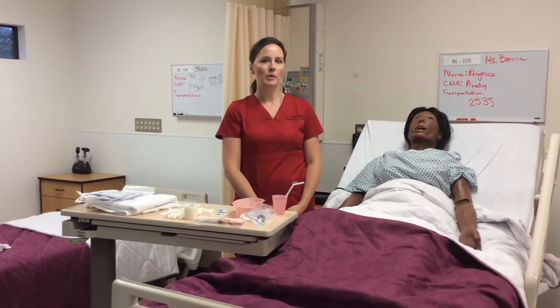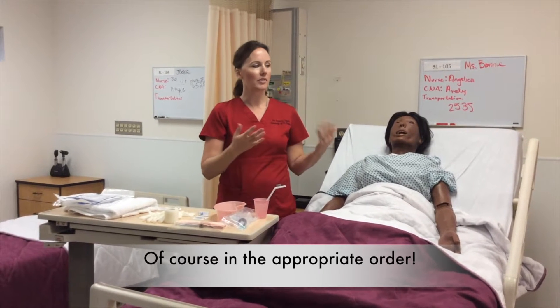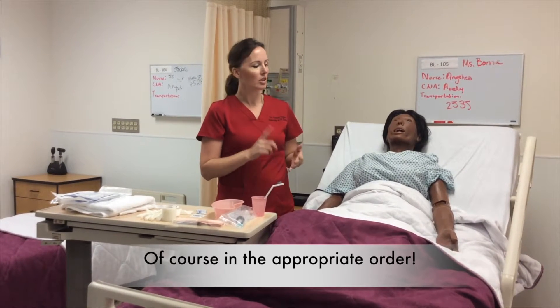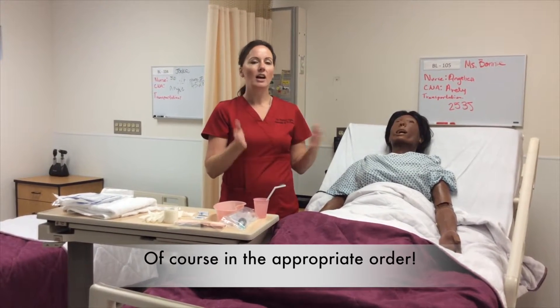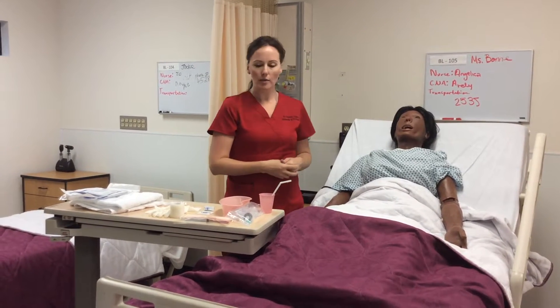I'm going to demonstrate nasogastric tube insertion. I've checked the order, washed my hands, provided privacy, explained to the patient, checked the patient's ID and allergies. I've done all my prep work, including positioning the patient to my comfort and her comfort.